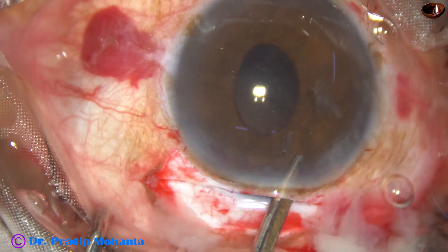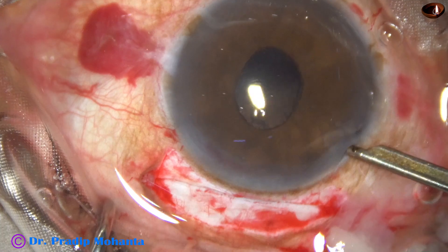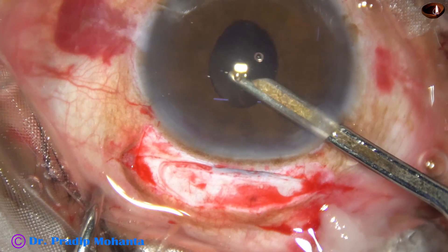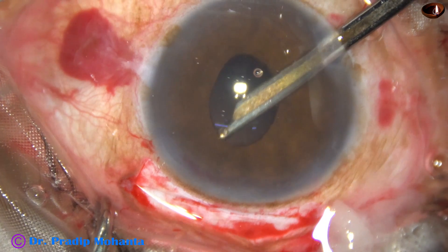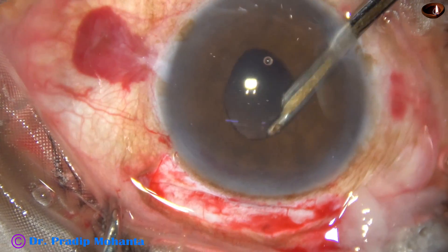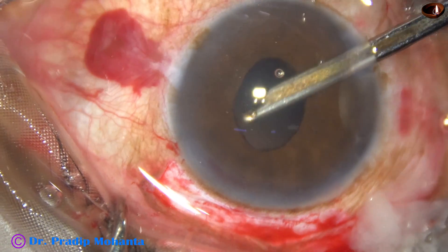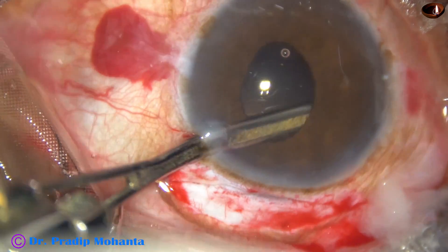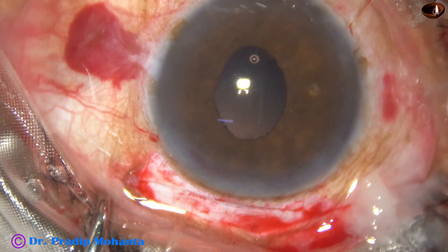The cortex and rest of the lens matter is then removed. I go through the main phaco incision and remove some cortex, then through the incision at 7 o'clock, through which I can very nicely remove the cortex from the superior aspect. Then going through the side port at around 2 o'clock, all the cortex is hopefully removed.